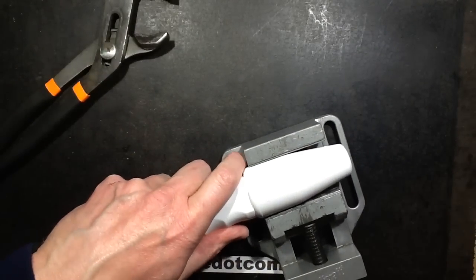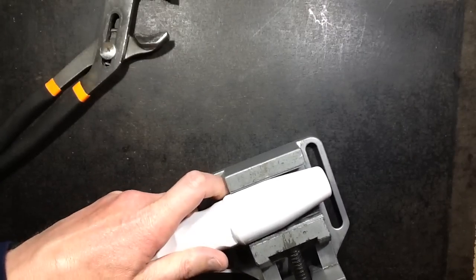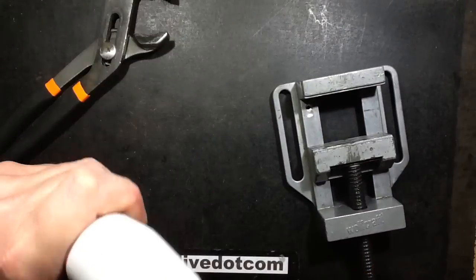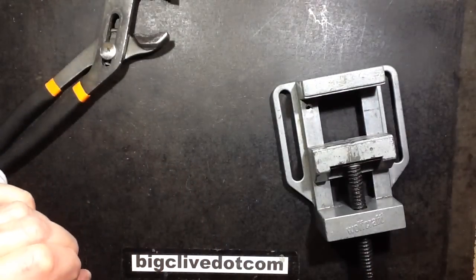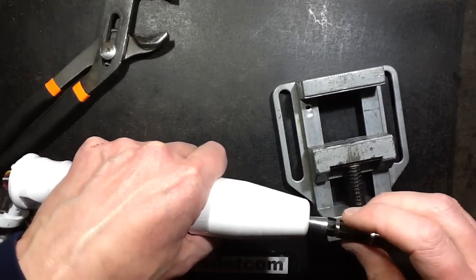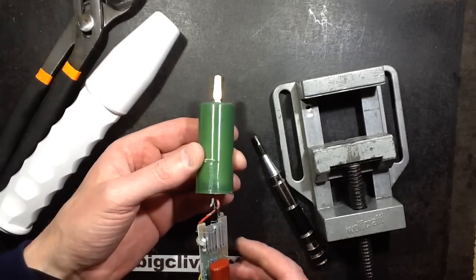This is maybe not going to come apart too easily. I may have to pause the video. I did notice a screw down the middle, but I don't know if that's actually holding anything in other than the electrode arrangement. Oh, you know what? I just saw that move. Here's the transformer. Oh, that's intriguing.